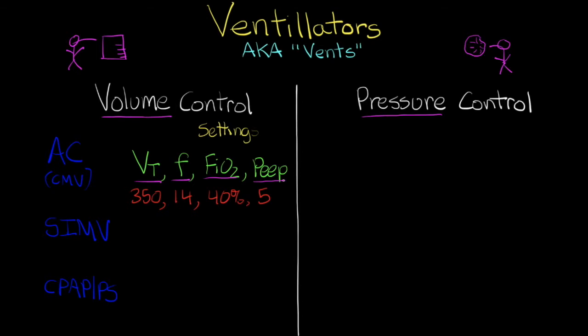And one final thing on that note: know that every single day our goal is going to be working towards weaning our ventilator support, and if a patient is able and capable of doing it, we should be performing a spontaneous breathing trial on these patients every single day, trying to get them extubated.